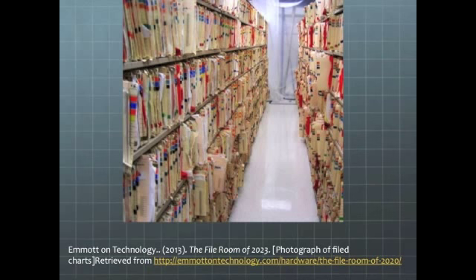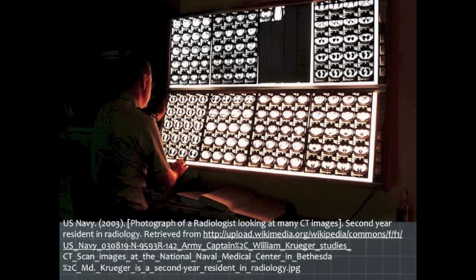Not to get you off subject, but those all require a huge database to archive all the images that are produced and shown on our X-ray screen. And we send them to PACS. And the beauty of it, what's so nice about it, you don't have to have a radiologist on site to go hang your films in front of. It's all computerized over the internet with tons of secure software, of course, because you're dealing with HIPAA issues now.